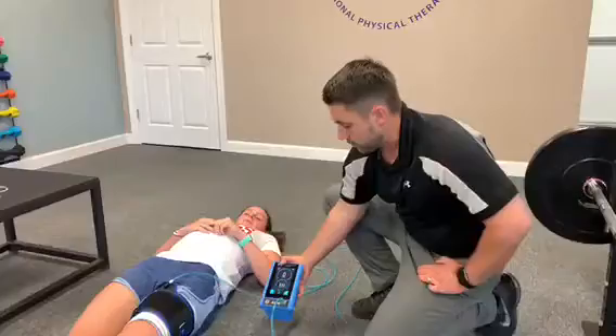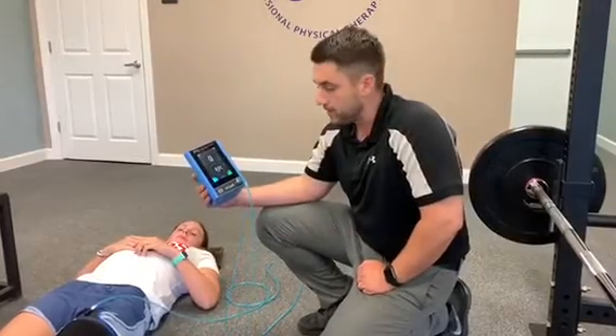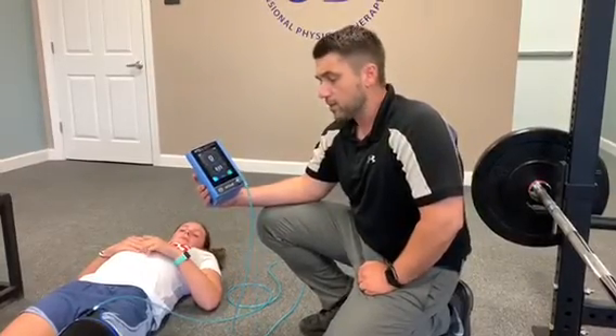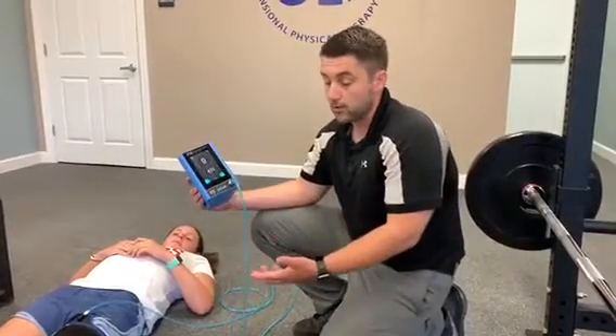We have our new technology for blood flow restriction, where we are cutting off 80% of the blood flow to the lower extremity. What this does is help trick the body into thinking that we are actually lifting heavy loads under lighter loads.